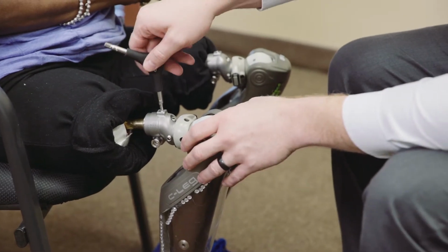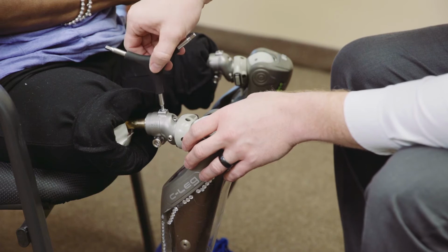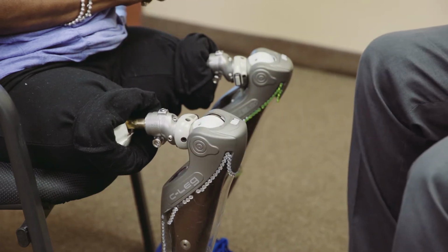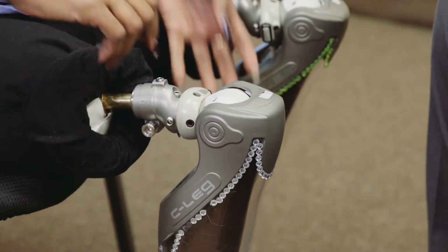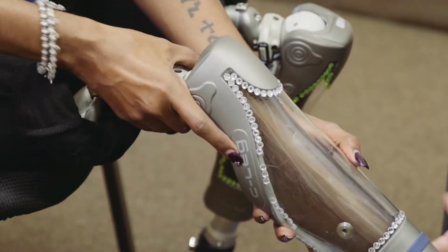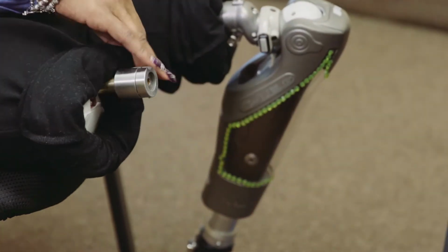One of the most important points with this set screw is that it does not back out all the way. There is a collar on the screw that prevents this. As the screw is loosened and you feel a hard stop, do not turn the screw past this stop. If the screw is backed out excessively, then it can become jammed on its collar.